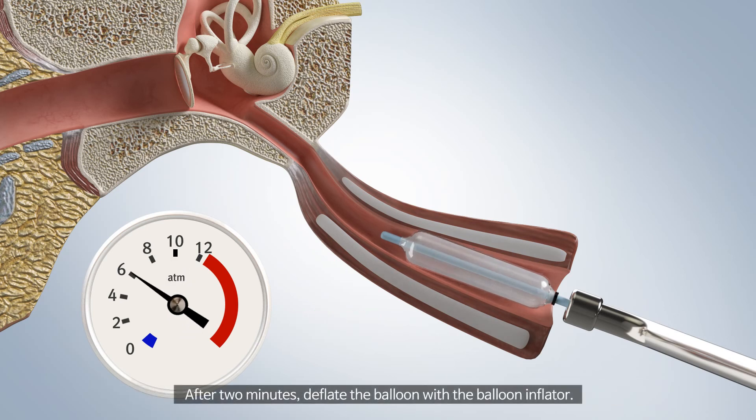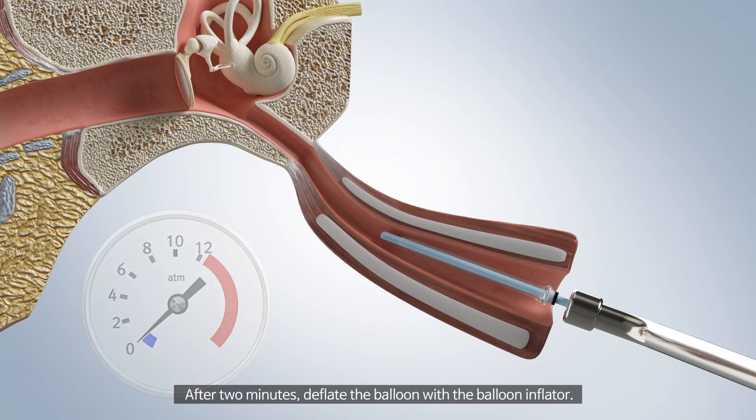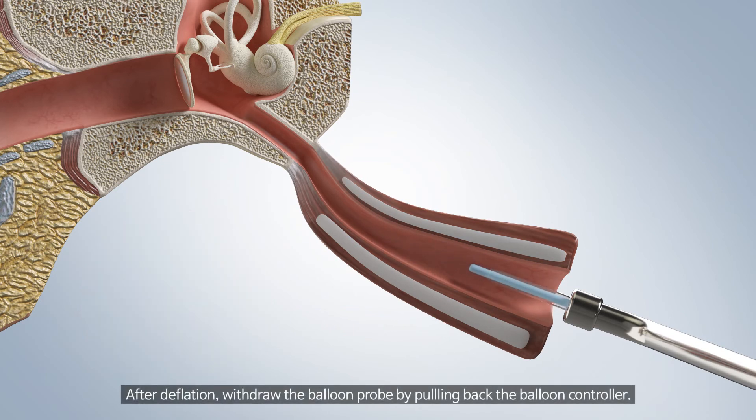After 2 minutes, deflate the balloon with the balloon inflator. After deflation, withdraw the balloon probe by pulling back the balloon controller.